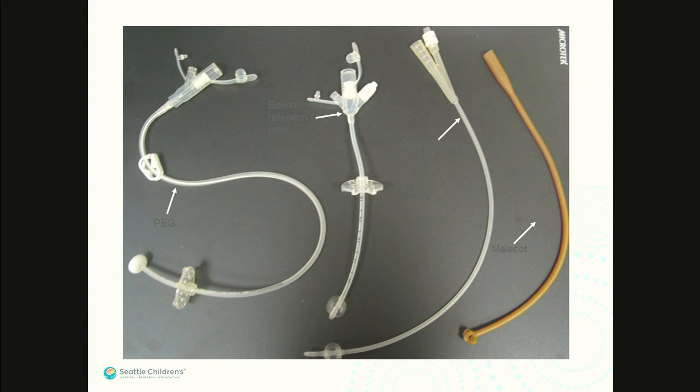It's really a good question. Thanks for asking that, because we've had a few nursing errors where somebody tries to put meds or something in through the balloon port by accident. It is possible to do that. Does it really hurt anything? Well, maybe not, but if you put very much volume in here, you'll probably break the balloon. It's definitely not ideal. So take note of where things go.